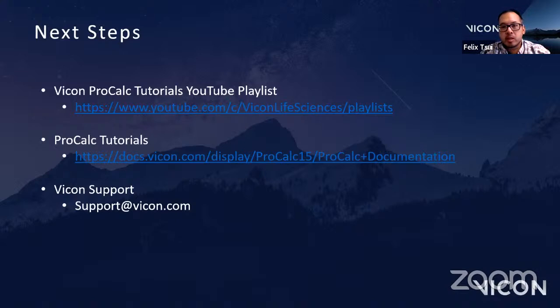Good. The next question we have is, are there any current or future plans to extend ProCalc capabilities by integrating scripting? Upon digging a little more into this question, it's more about trying to import custom calculations or equations. Well, if you have custom calculations that you're performing elsewhere and saving as model outputs, all those will show up in ProCalc. I don't think there's anything in the plans to add any scripting capabilities to it.